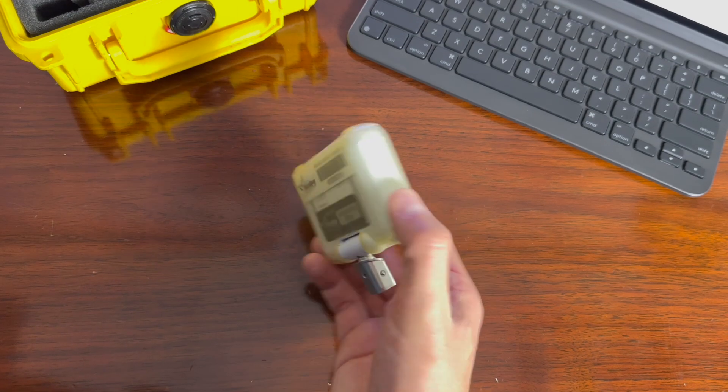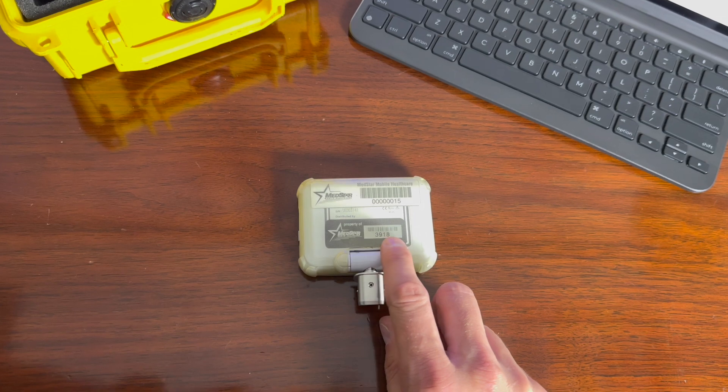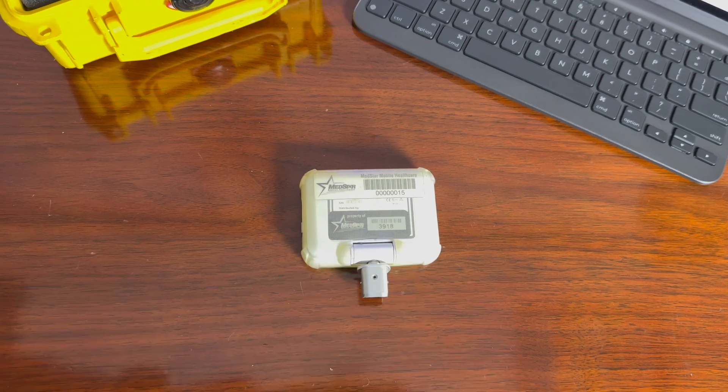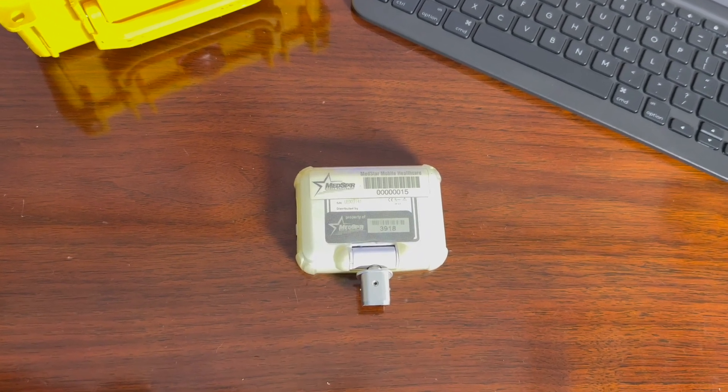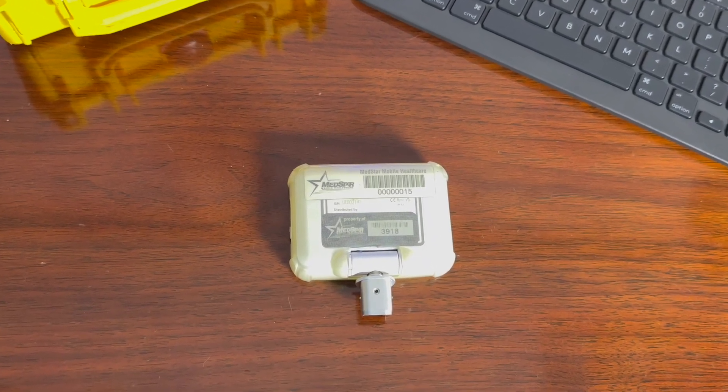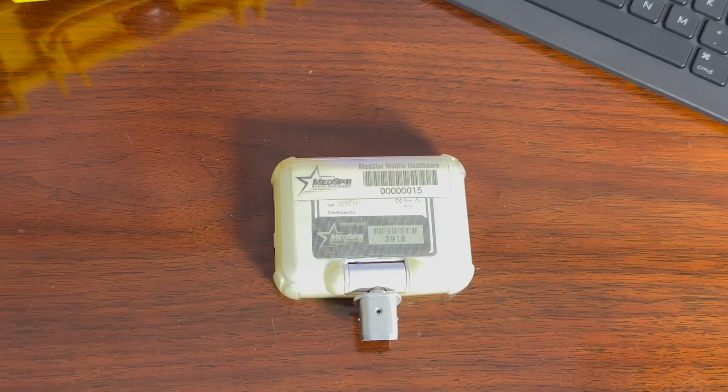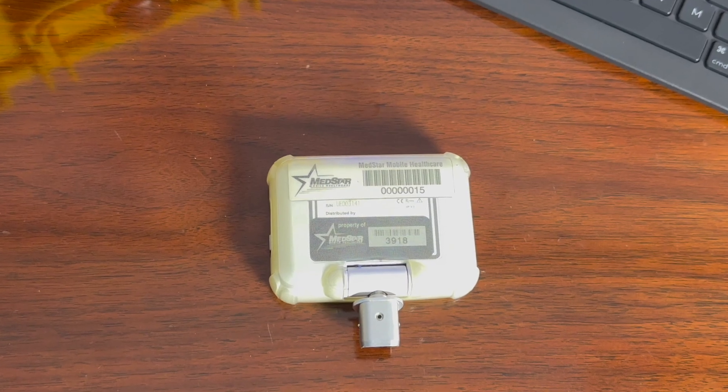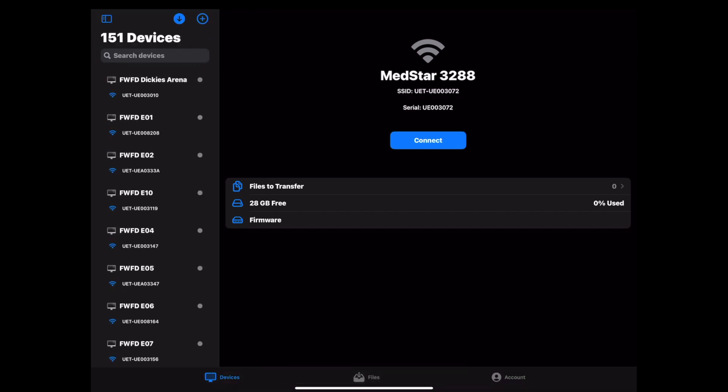If the intubation was performed on a MedStar device, flip the UE Scope device over and you'll find the four-digit asset ID number. Don't use the longer number with the multiple leading zeros on the white RFID tag. Next, you will type in the search bar your device's asset ID number and you should find it listed there.